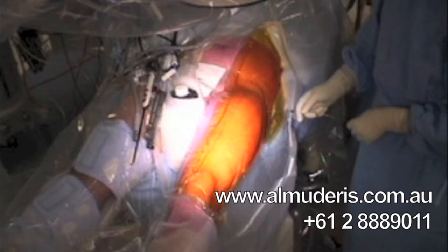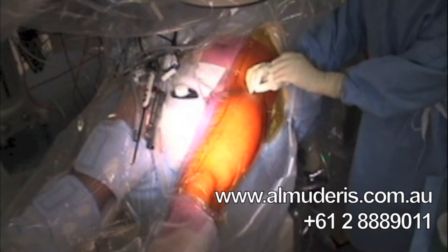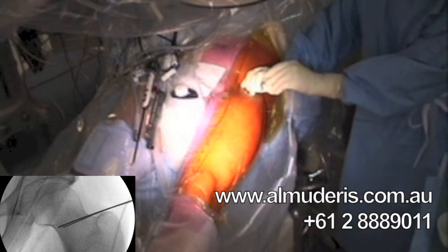I insert the guide wire inside the cannula, X-ray, save this one, and then we remove the cannula. Okay. Then I enter the neck through the anterior portal. I make my portals directly before I start the case, X-ray. My needle is skiving over the femoral neck, as you can see here.